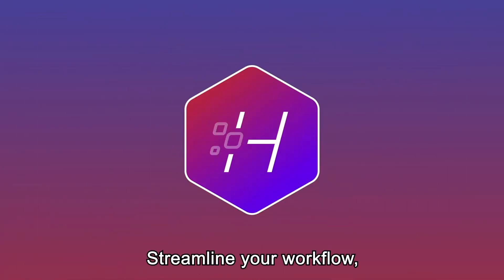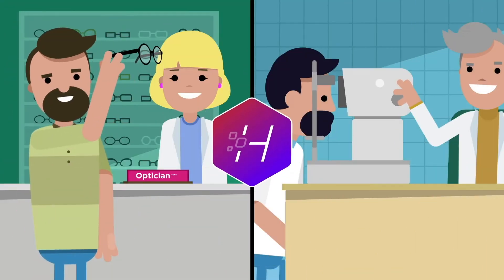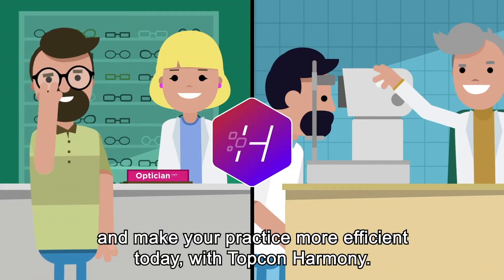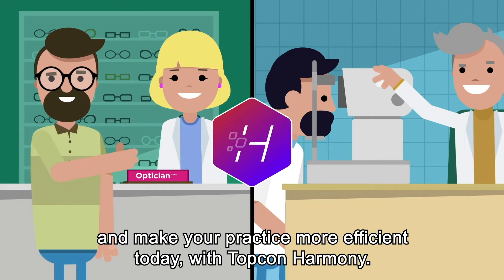Streamline your workflow, achieve data control, and make your practice more efficient today with TopCon Harmony.